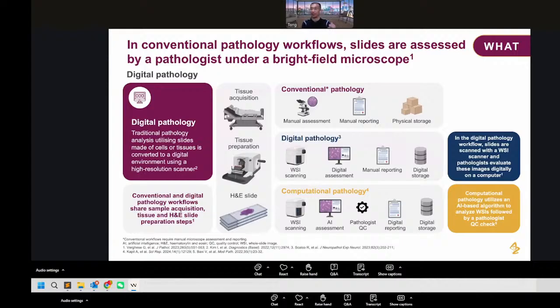So that is the tissue you take from the patient, but you have to prepare the tissue on slides for the pathologist to look at: is it malignant, is it a cancer cell or not? What's the histotype, the histology type? Is it adenocarcinoma or others? Those kinds of things are the same procedure.